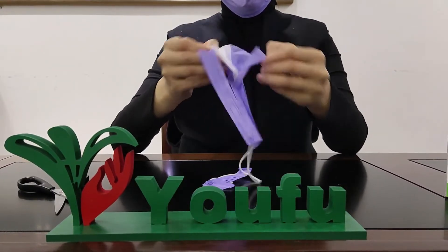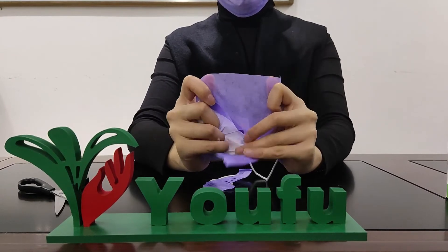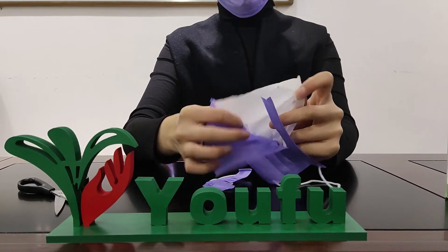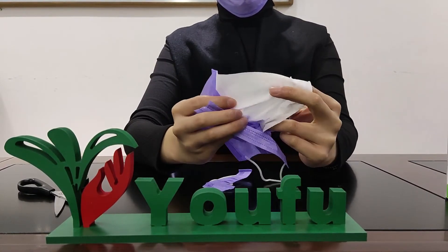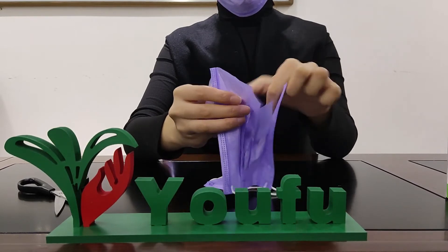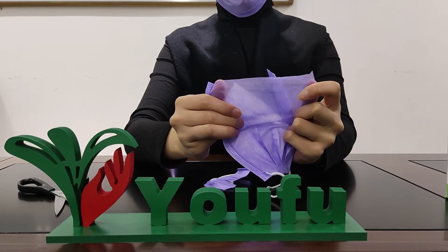It has three layers. The outside layer is 100% virgin non-woven material, purple color. The middle layer is made of white melt blown, with bacterial filtration efficiency around 99%. The inner layer is also made of 100% virgin soft non-woven material, purple color.